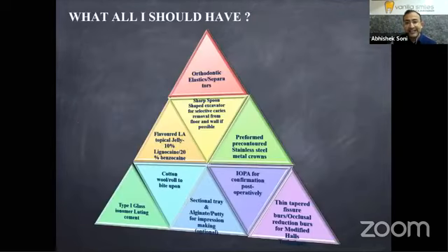What are the armamentarium that you require? You need your orthodontic elastic separators in case of tight contacts. You need a sharp spoon-shaped excavator. You need a topical jelly or your anesthesia by your side. Your sectional tray and putty impression making is optional; that will probably help you in crown selection. And at times the separators may sit gingivally and you may not achieve the desired separation. In those cases, you may need a TC26 tapered fissure bur.